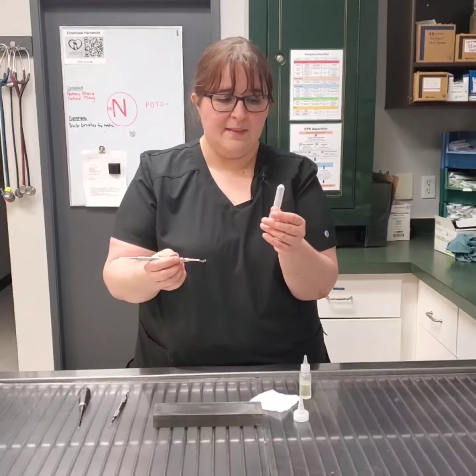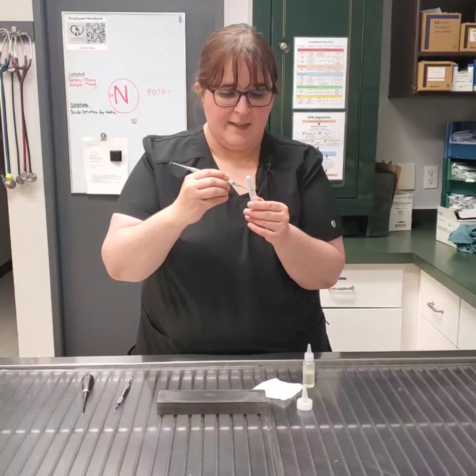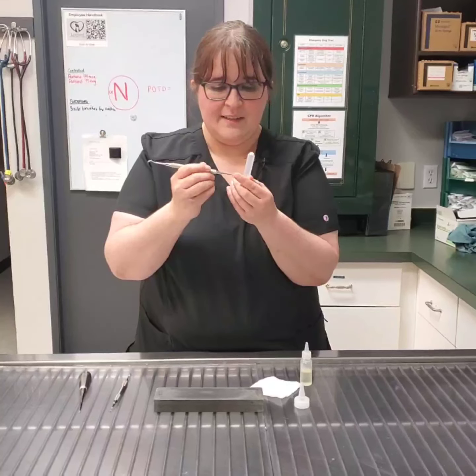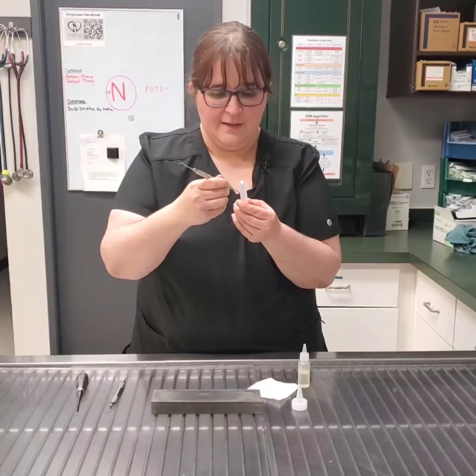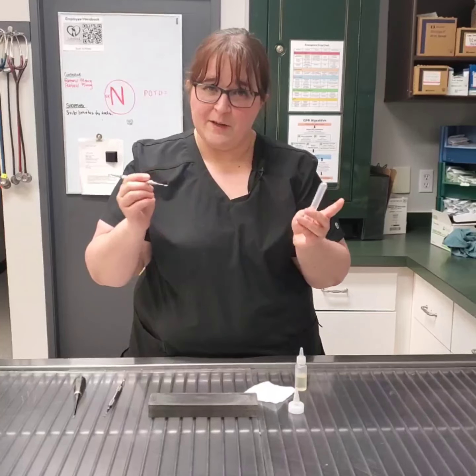So this will be used to see if it catches, and right now it's not, it's just sliding, so you can tell that this is a very dull instrument, so we're going to sharpen it.